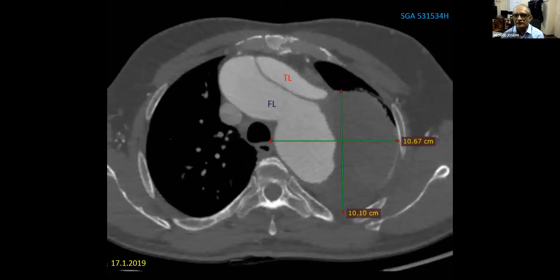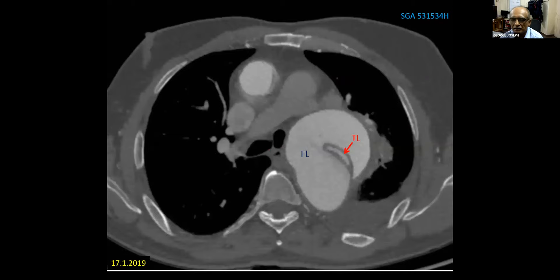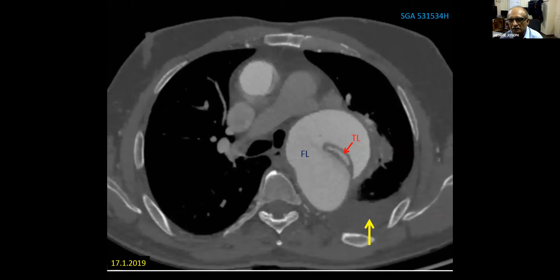On the cross-sectional CT angiogram, the false lumen is really giant — more than 10 centimeters in both dimensions — and the true lumen is squashed by the false lumen. It is quite anteriorly located. In another cross-sectional image, the false lumen wraps around the true lumen, which is extremely narrow at this point, and there is some blood in the left pleural cavity, indicating this is probably a contained rupture.